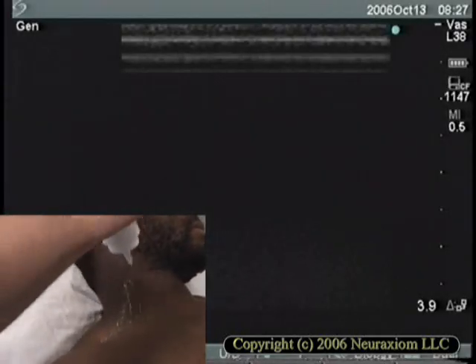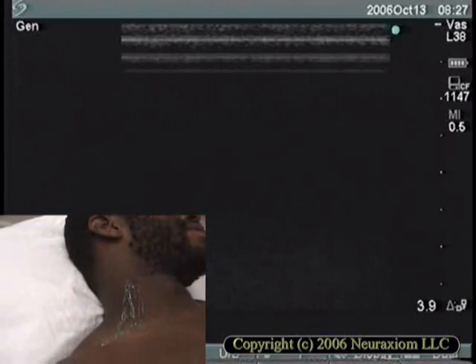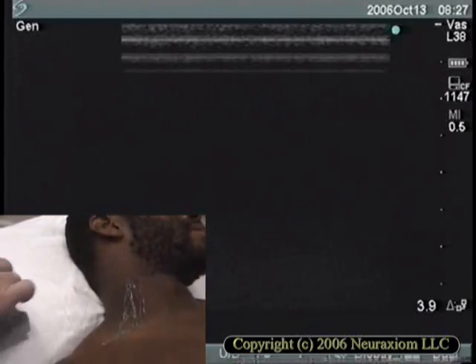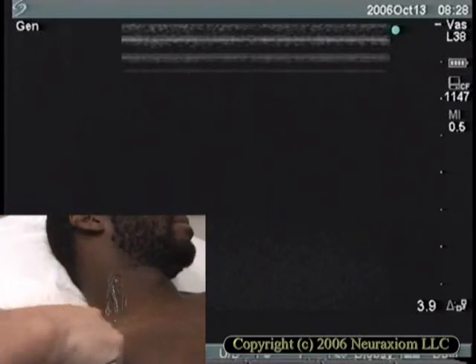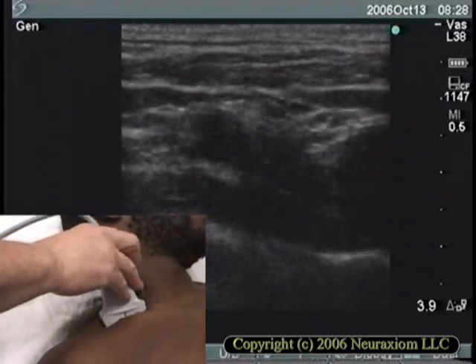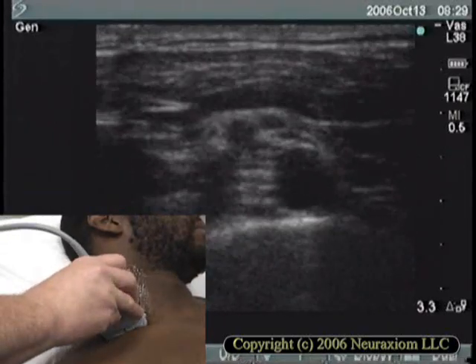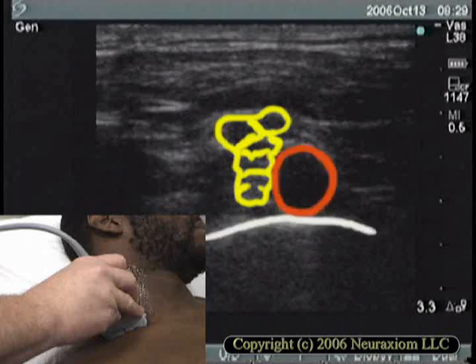We'll start right off by using a lot of ultrasound gel. In order to find the interscalene space, we're going to start in the supraclavicular. You see here the clavicle, the line of the sternocleidomastoid. We're going to go right behind the clavicle and let the probe nestle right there. Immediately we see the subclavian artery with the brachial plexus sitting above and behind. The bright line below the artery is the first rib.